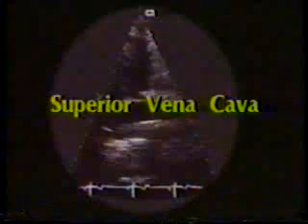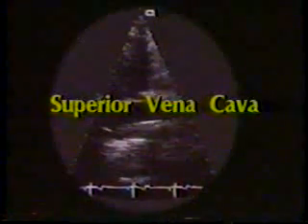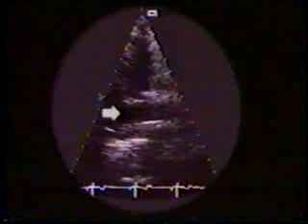Utilizing the suprasternal and supraclavicular positions, we can define the position of the superior vena cava and also can determine if a left superior vena cava is present. This is the right supraclavicular view of the superior vena cava. Here is the right pulmonary artery. In real time, you can note the position and the normal flow pattern in this superior vena cava.